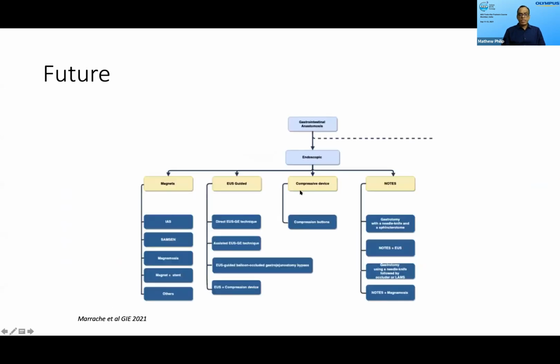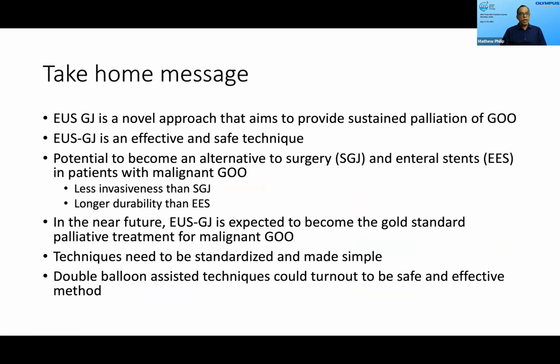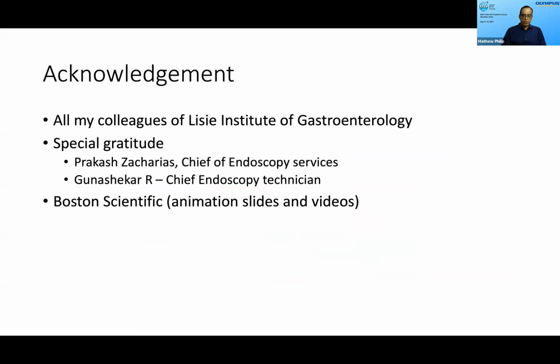And these are different types of EUS-guided techniques as well, and magnets, knots, so many others are coming out. So I personally think that EUS-guided procedures, especially using double balloon with a segment of distended bowel with liquid, is a very useful technique, and this is going to be very useful in the future as well. So we cannot take it for granted.